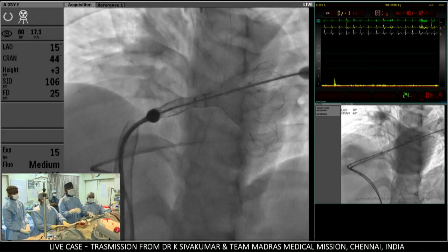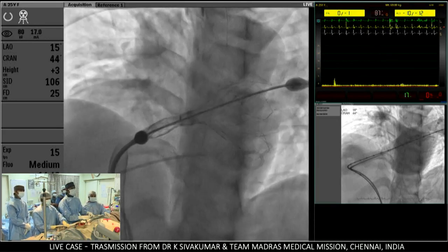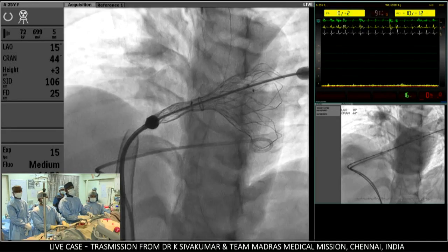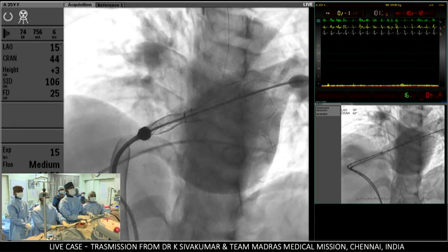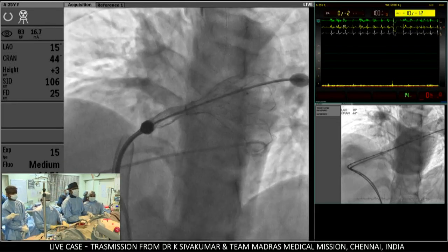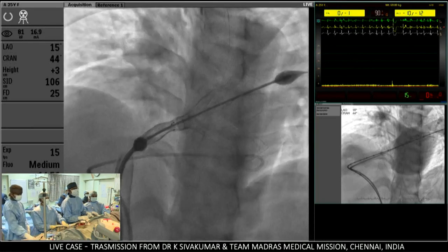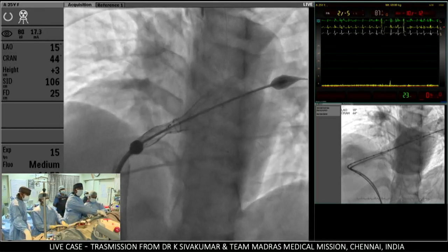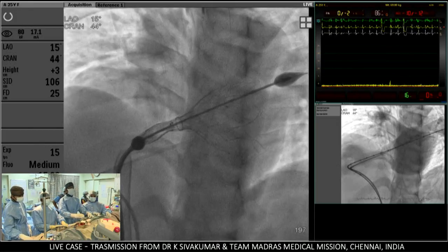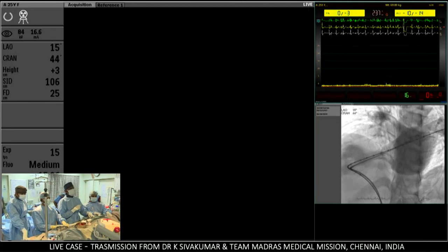Yes, Varakan. Shiva, if I were you now, I probably may not open more. Yeah, but we'll pull back until we are close to the waist. Ready? Okay. Yeah, now you have to go back significantly. Okay. Now, get ready. Another injection. Go a little up. Yeah. Ready?